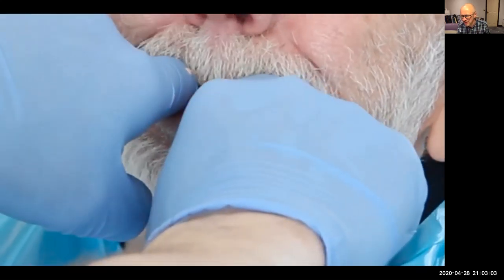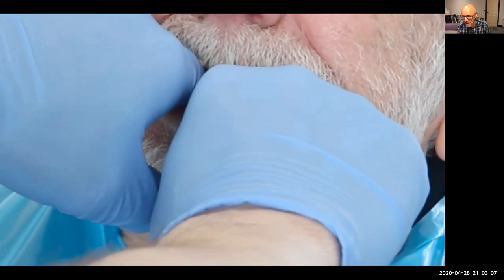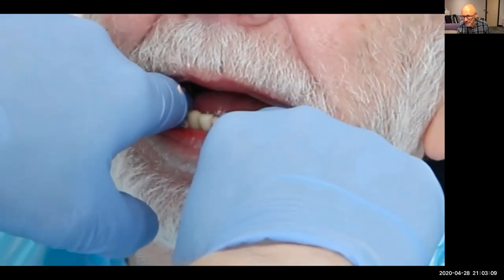Push the tongue against the lower front teeth, 4. And powerful swallow of water, 5. So we do repeat those, and we do that twice. So it's 5 movements. It's ooh, lick the lip, push against that strut, powerful swallow, and lick the lip. 5 movements. So repeat that twice with zinc oxide.